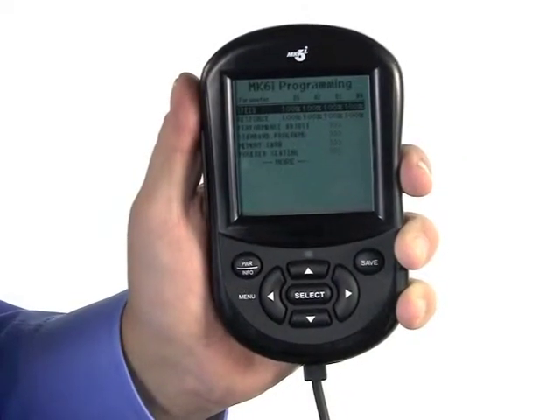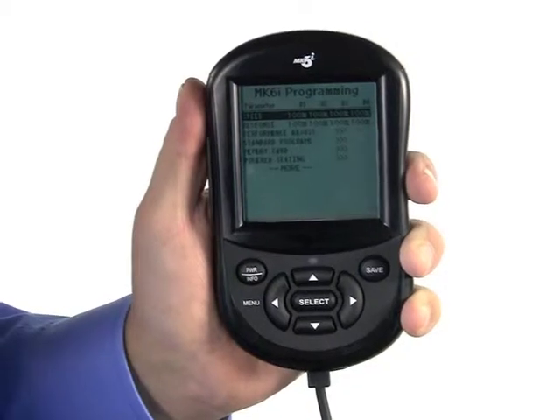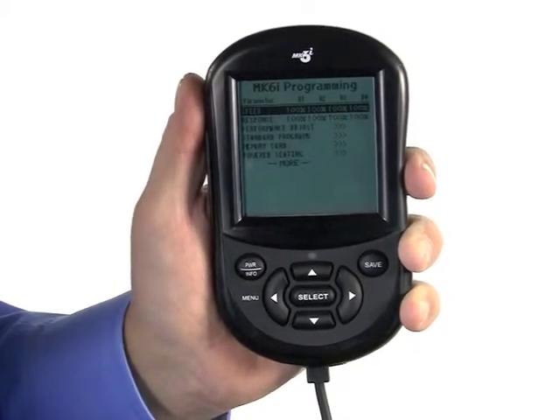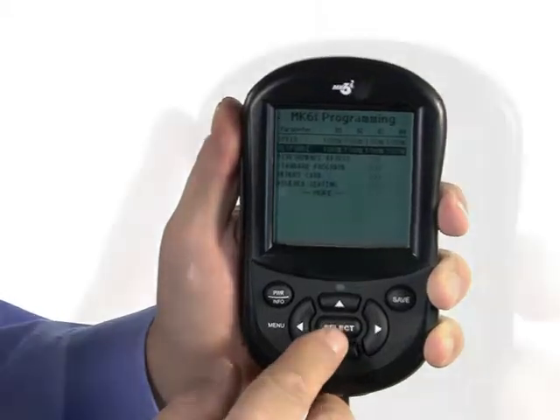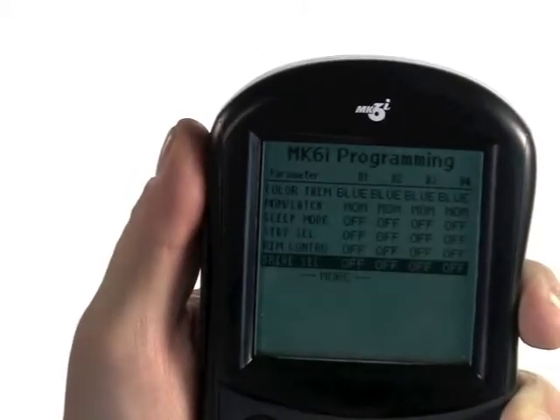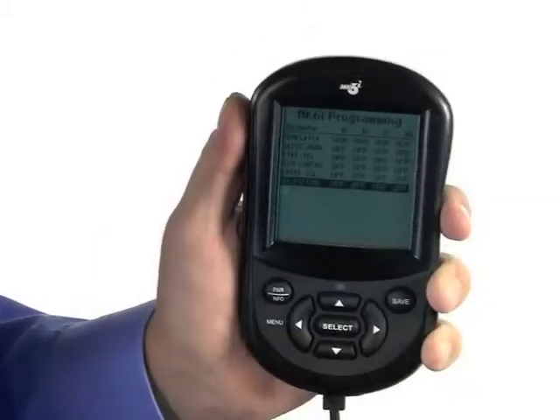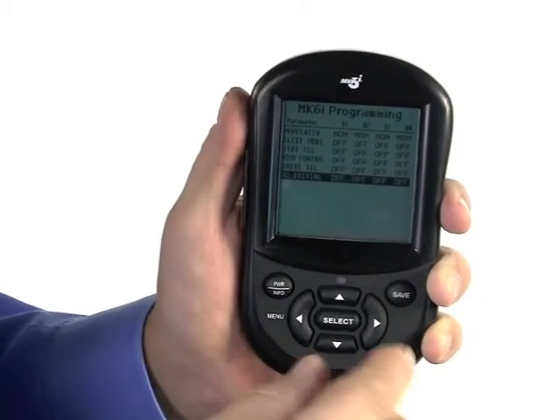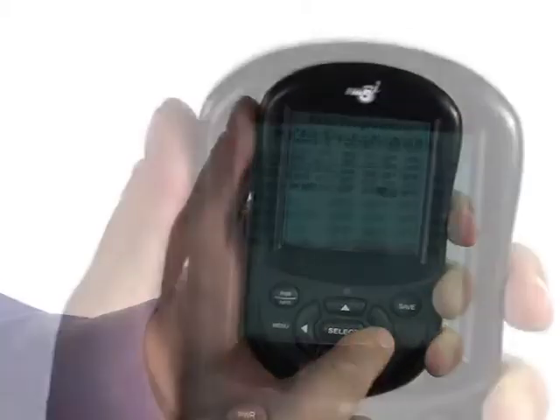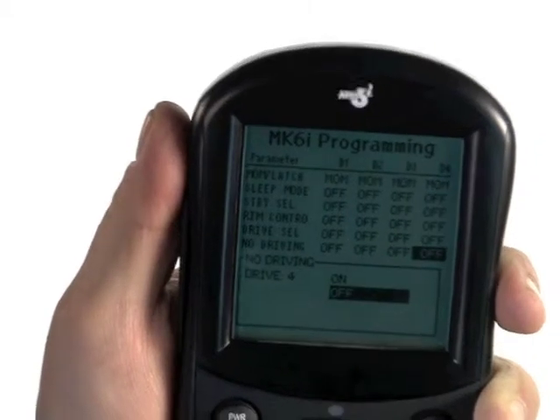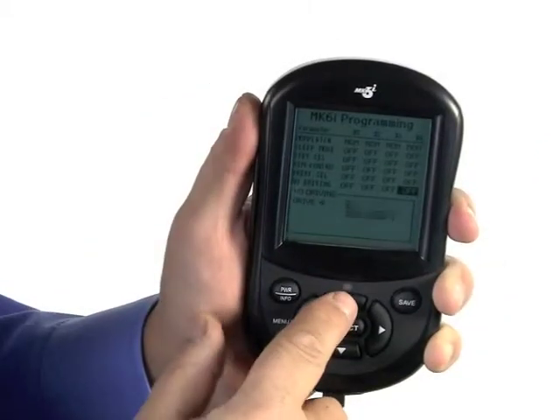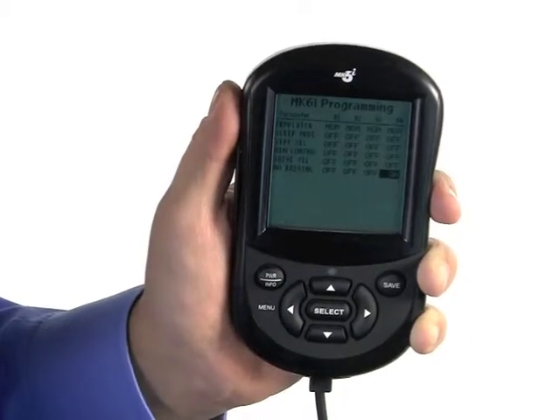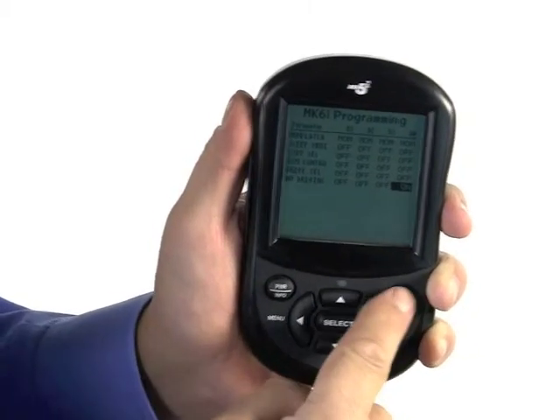First, turn no driving on in drive four. Go to performance adjustments and scroll down until you find no driving. Scroll to the right with the right arrow to drive four and press select. Choose on and press select again. Save your changes by pressing the save key twice.